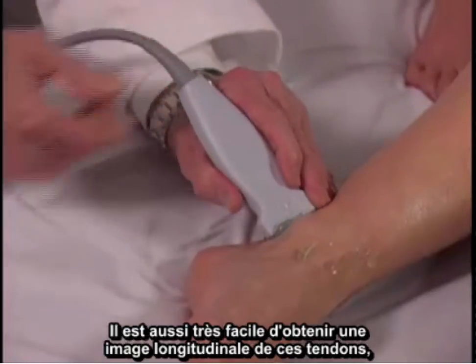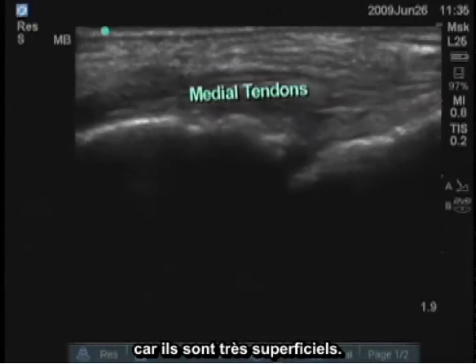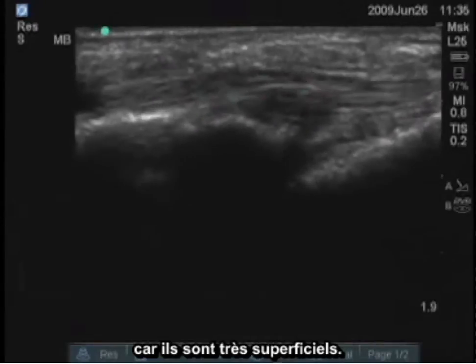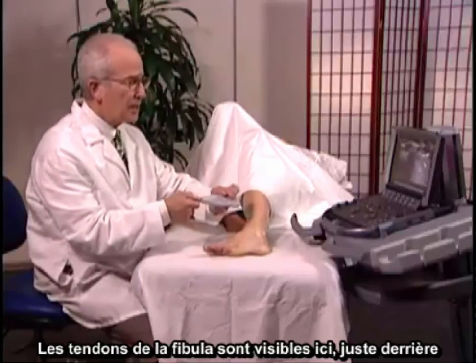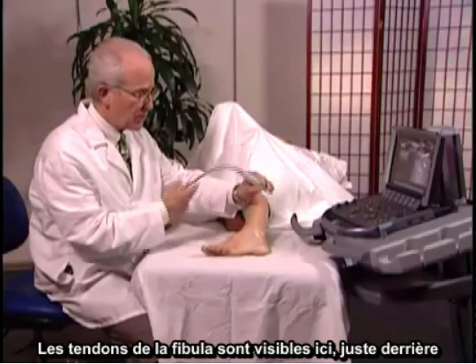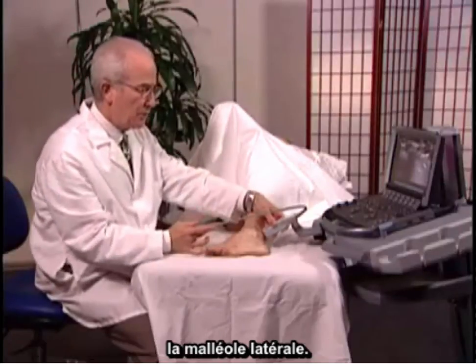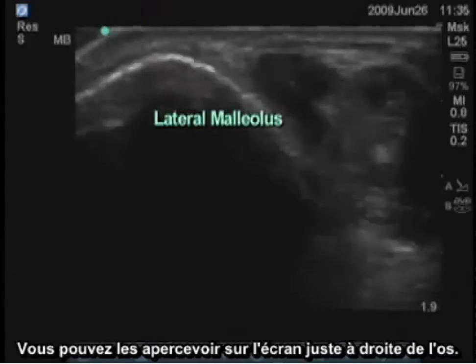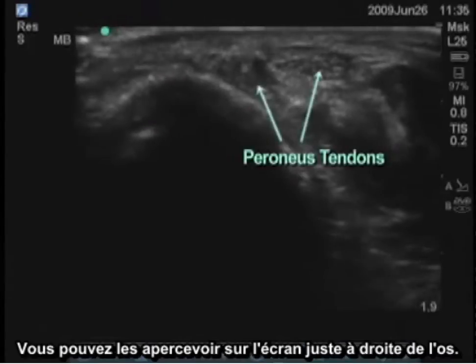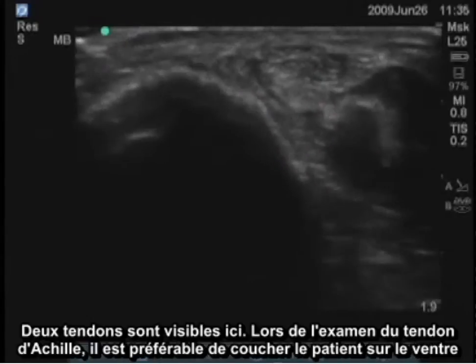A longitudinal image of those tendons is also very easy to obtain because they're so superficial. We can then look at the lateral aspect of the ankle, where the peroneus tendons are present just posterior to the lateral malleolus. You can see them on the screen just to the right of the bone — there are two tendons there.